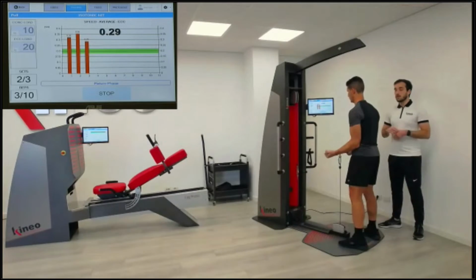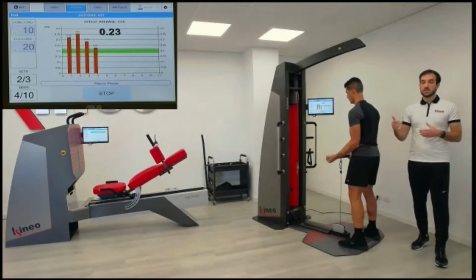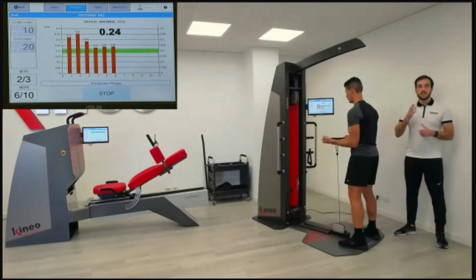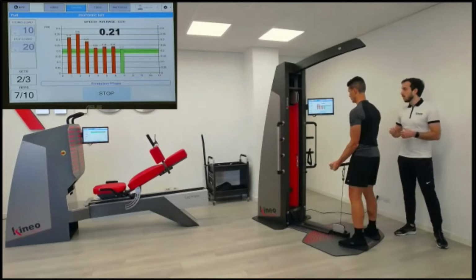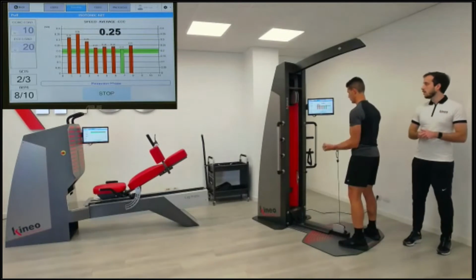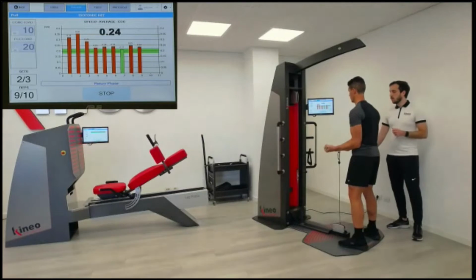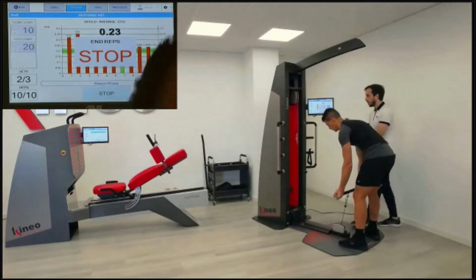Slow down in eccentric. Of course, this is part of the learning curve that eccentric has with this type of training methodology. It's not for everyone to just keep 10 kilograms, 20 kilograms in a very correct way. There we go, a green one, we have it, 0.21, very good. Take a look also at the screen, Damiano, don't worry. Just to slow it down, perfect, that's good. All right, perfect, thank you.